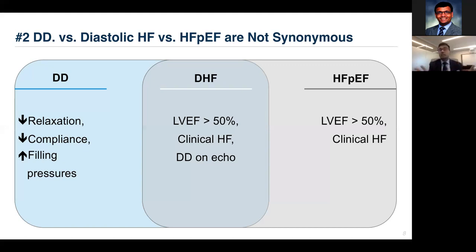So these concepts currently are not very coherently described in the literature, and different phenotypes are described. But it is important to understand that in heart failure with preserved ejection fraction, many patients may not have all the criteria suggesting presence of diastolic dysfunction, versus some people have more profound features that suggest cardiac factors are involved as a mechanism of heart failure with preserved ejection fraction.